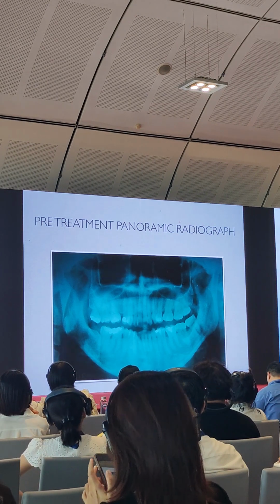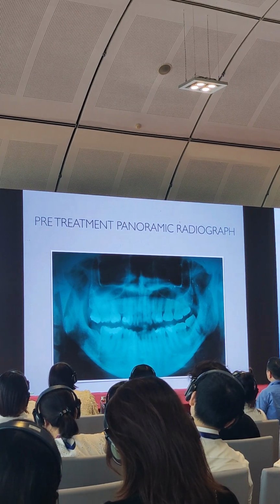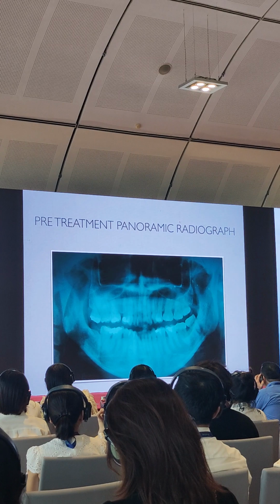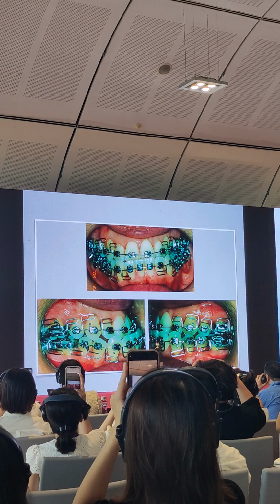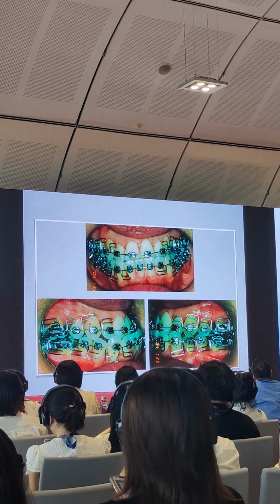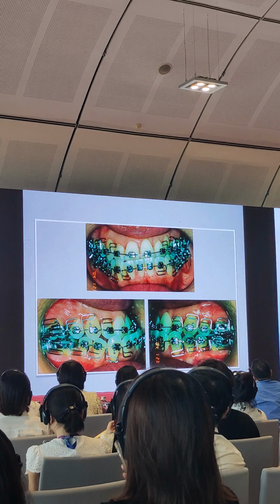After installing the brackets and placing the nickel-titanium wire, she left already. Then I saw her back again after 6 months. She came back to the Philippines for a short vacation, and now teeth are fairly aligned. Then I changed to my MEAW and placed all the bends. If you look, I did individual ligation because she will leave again to her work. So I just gave her a lot of elastics.